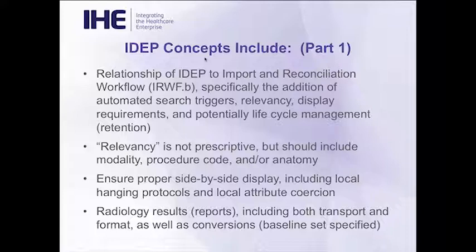We want to ensure that side-by-side proper display, including the ability to use local hanging protocols, will work. As Dr. Koff described earlier, how important it is to be able to do the measurements the same way at the same time. And to do that, we define a set of attributes, DICOM attributes, which will go through conversions so that they appear local, such that the side-by-side hanging protocols will work.